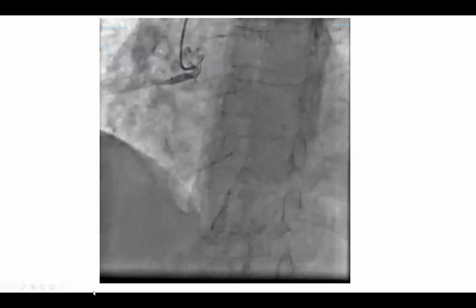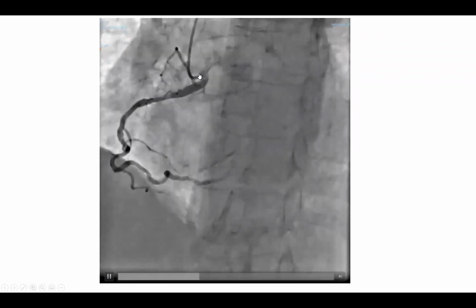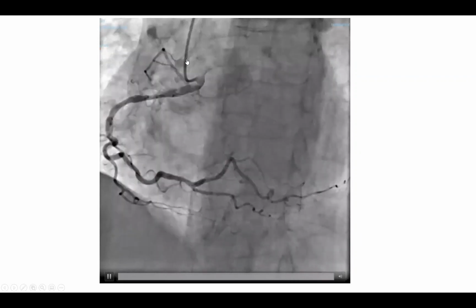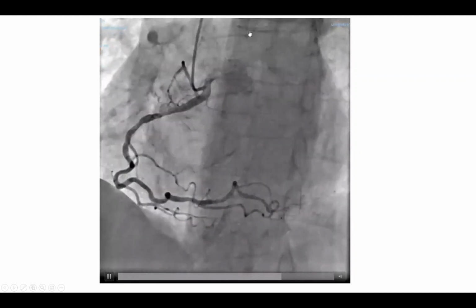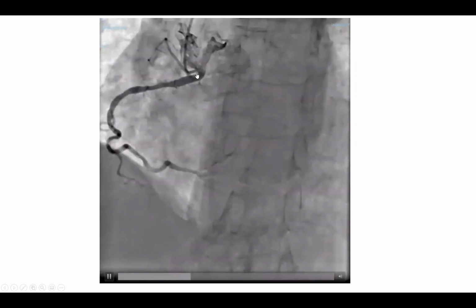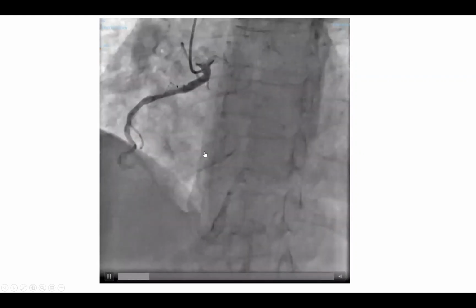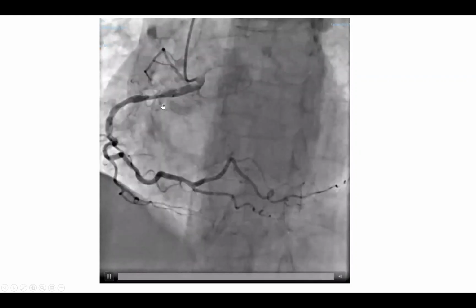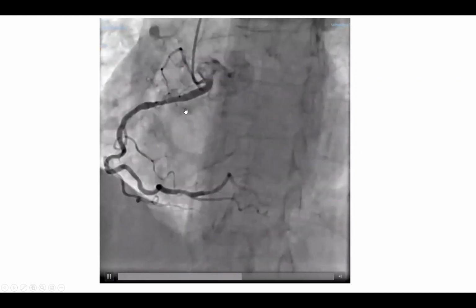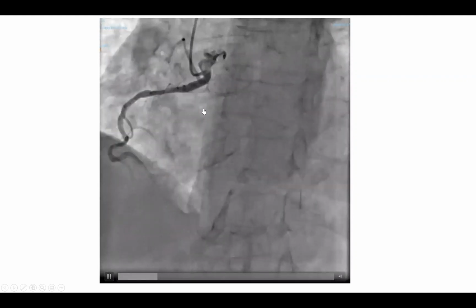This is another example. Again, what can you tell about that right coronary artery? This is an LAO view. The catheter is on my left hand compared to the spine. So this is an LAO view. And the catheter is looking at me as it's engaging that RCA. Again, this is an anterior RCA takeoff, okay? You need AR2 or AL1.